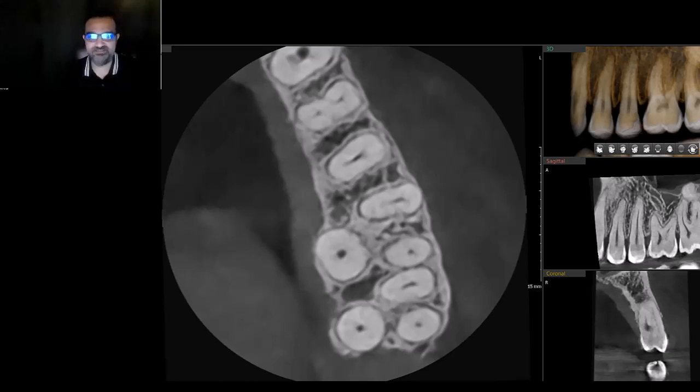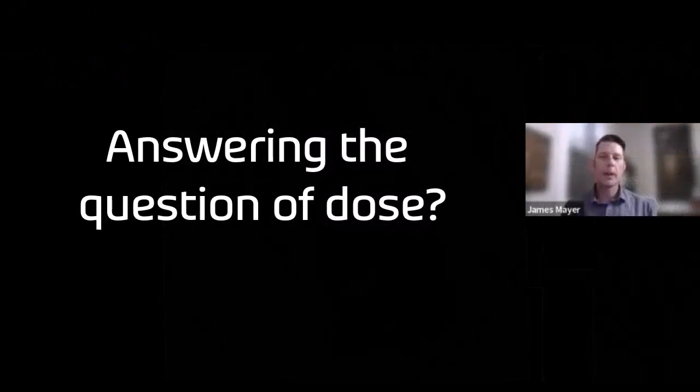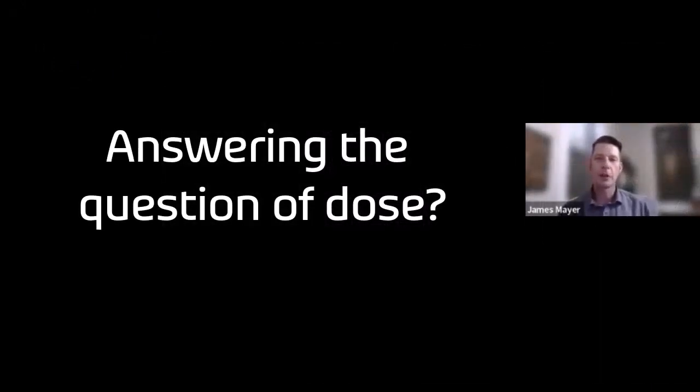It goes into the details of radiation physics, which I won't bore you with, or even in the beginning it flew over my head. But just remember, the smaller field of view that you take, right, you're gaining a lot of detail. Let's talk about radiation dose, and I will let you kind of start the conversation here.